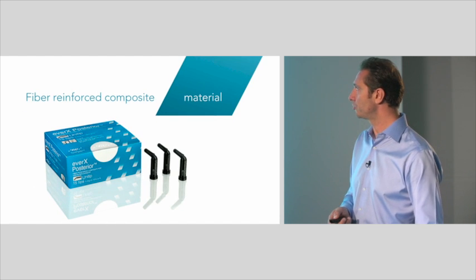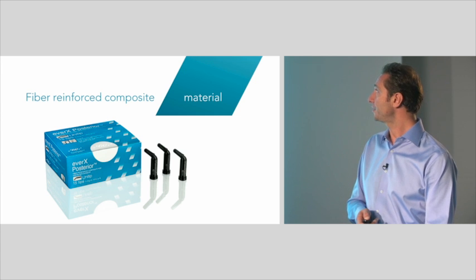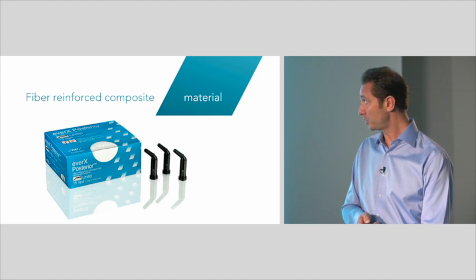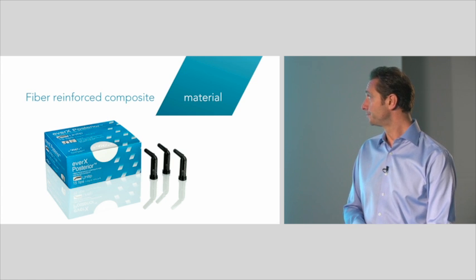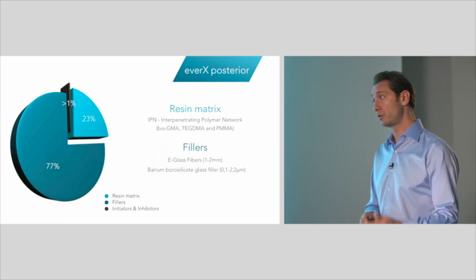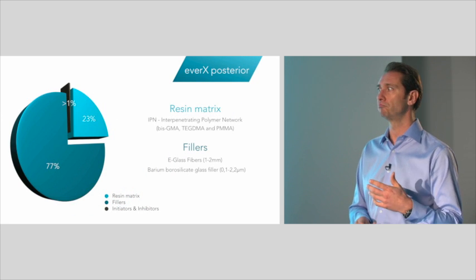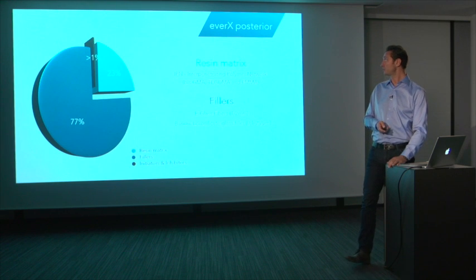Inevitably, it leads us to introducing the material that we're focusing on today, and this is the Ever X posterior, a fiber reinforced composite material that, in my opinion, can answer a lot of the questions and can give a solution to a lot of the problems that we touched in the beginning of the presentation.